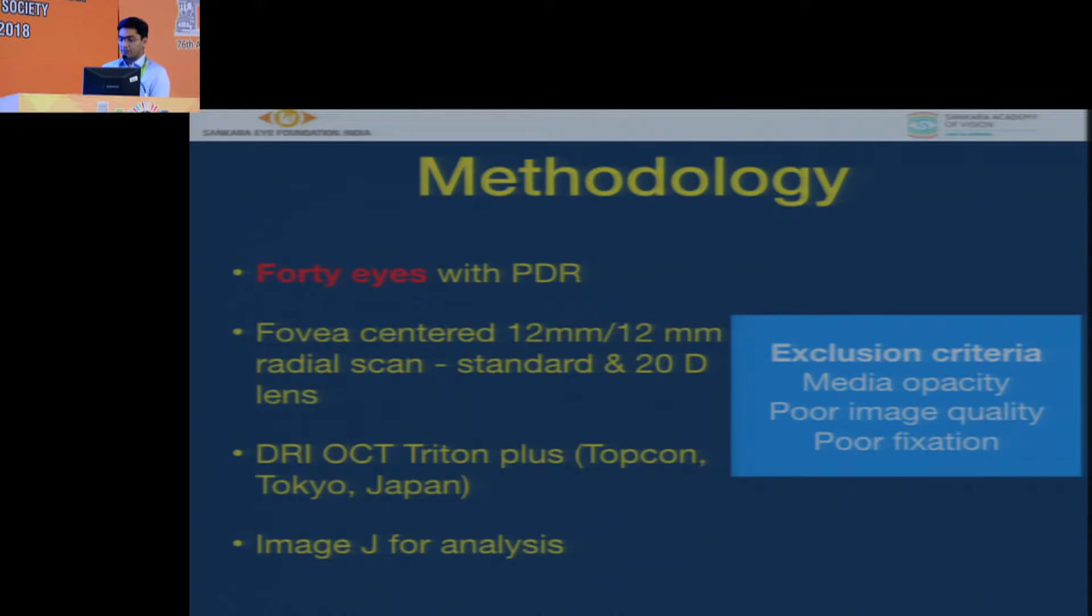So we started our study which included 40 eyes in which we had done a 12-by-12 scan, a radial scan by a standard and a 20-diopter lens using a DRI Triton SS OCT and the images were analyzed using an ImageJ software. The exclusion criteria was media opacity, poor image quality, or poor fixation.